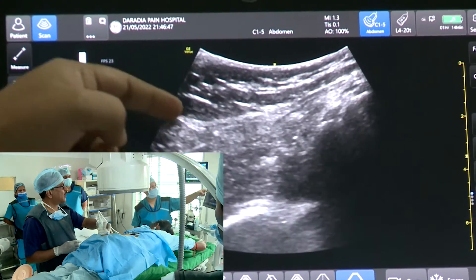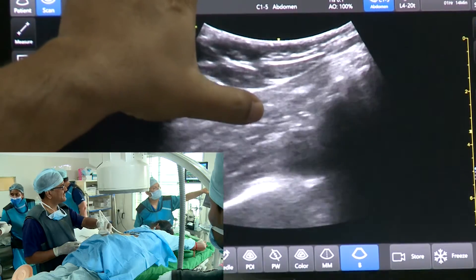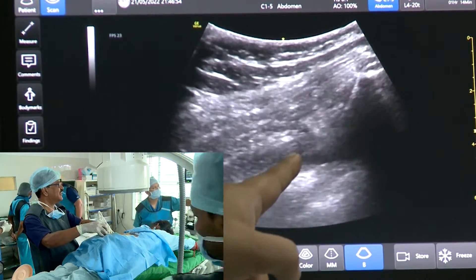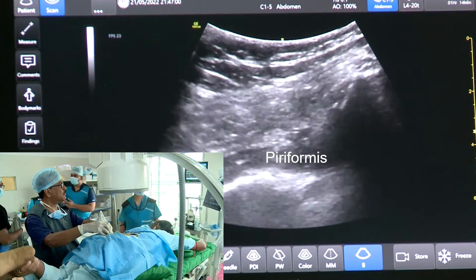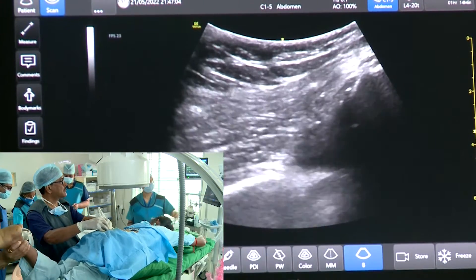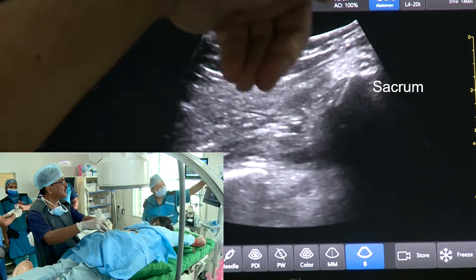This upper one is gluteus maximus and here is the piriformis. You can see the movement when you are doing the internal and external rotation — the piriformis muscle is nicely rotating. This is the moving piriformis; this side is the sacrum, and this piriformis is going under the sacrum.